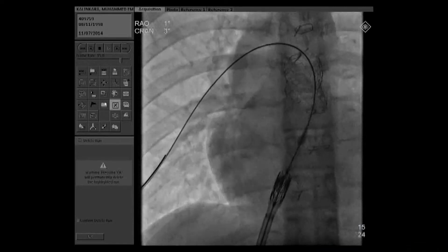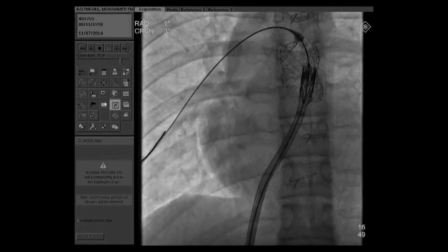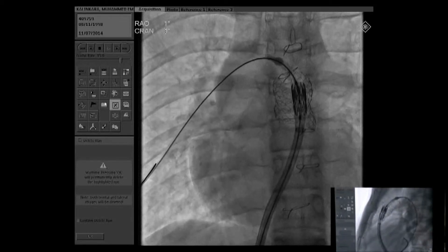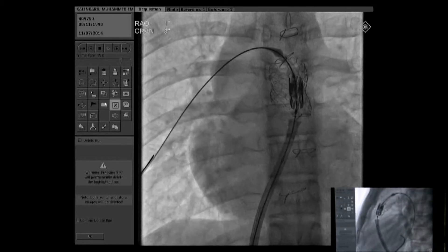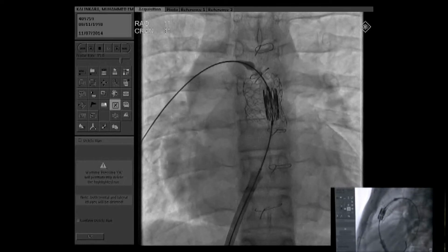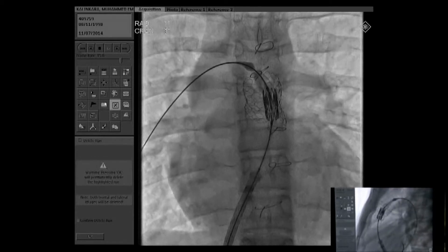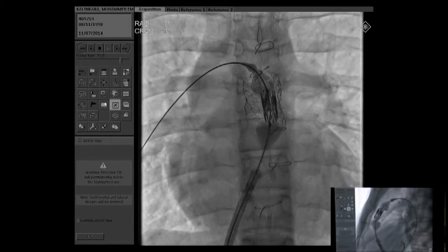Can you see the Sapien valve? Crossing the valve — easily crossed. Which valve is it now? 26mm Edwards. You see the slow inflation of the balloon during implantation of the valve.